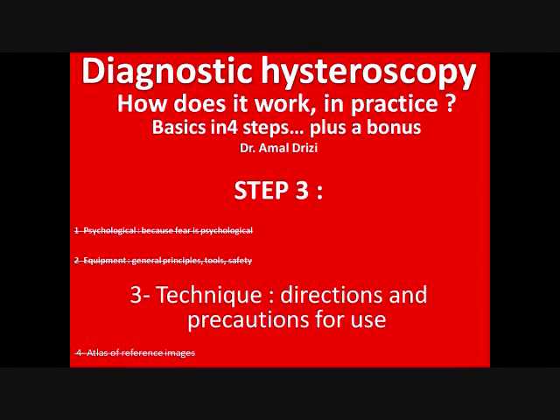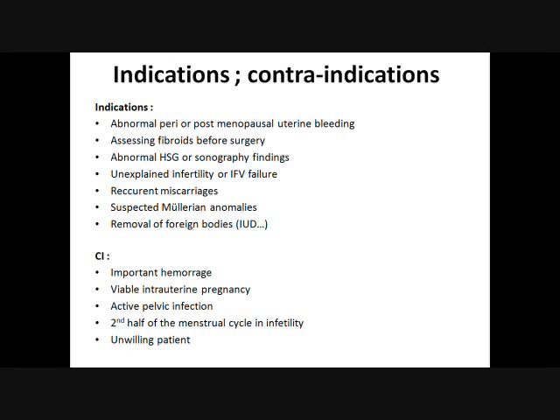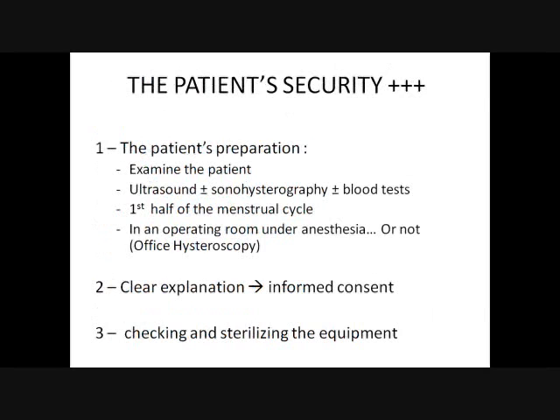But before, we have to know about the indications. There has to be an indication to perform a diagnostic hysteroscopy. It's very important. And here are the indications here. Plus, we have to make sure that there is no contraindication to it. And here's the list. The golden rule is patient safety first and very important. Yes, patient safety beyond any other consideration.